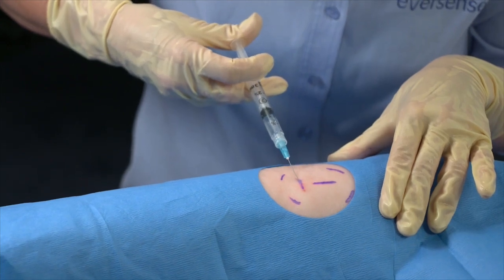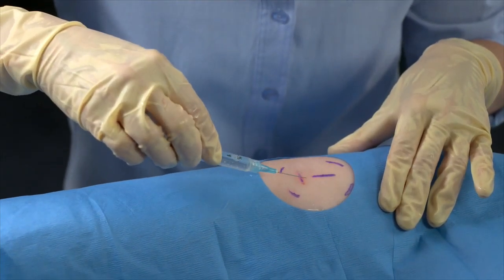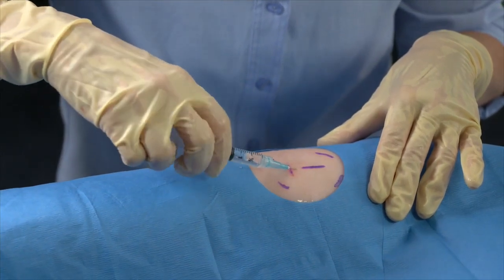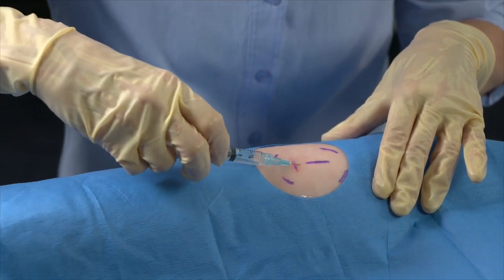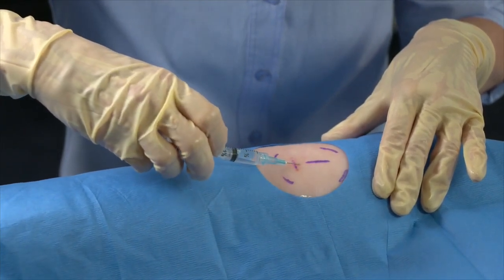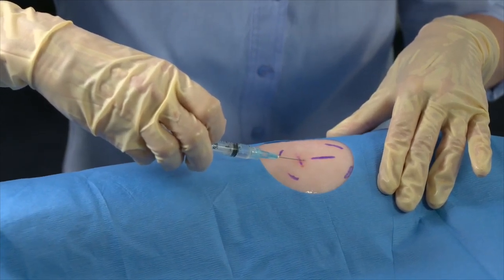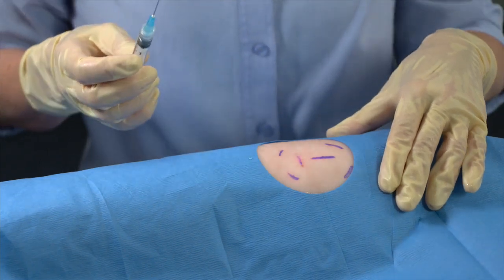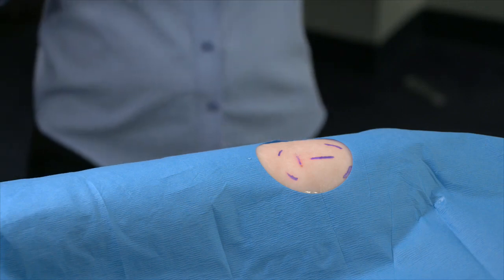Remove the syringe from the incision line and insert it at the distal end of the vertical sensor pocket path. Aspirate for blood return. Again, if blood appears in the syringe, remove and redirect the needle, repeating the aspiration step. Inject the lidocaine while slowly withdrawing the needle along the planned vertical sensor pocket path. Place the syringe in the sterile field and gently scoop its cover back on.